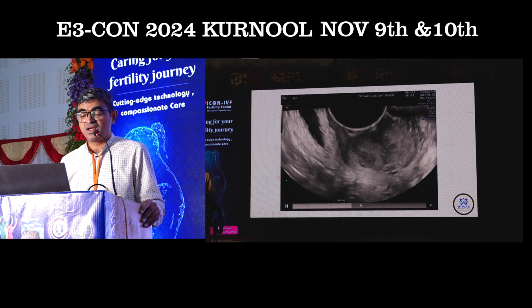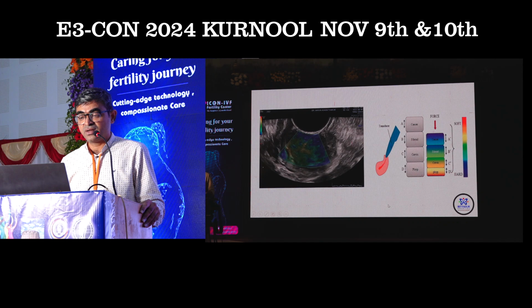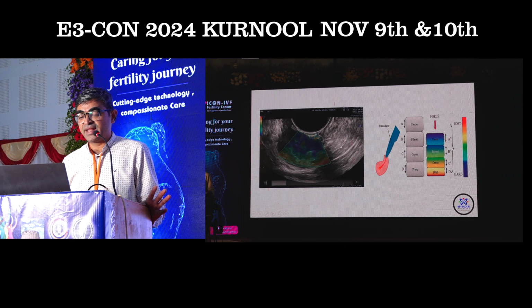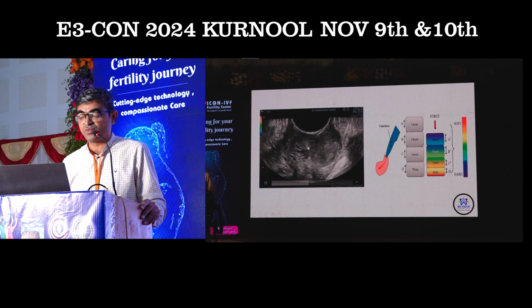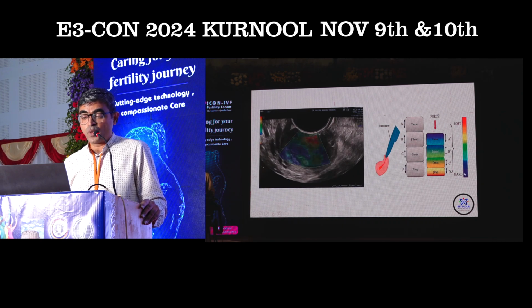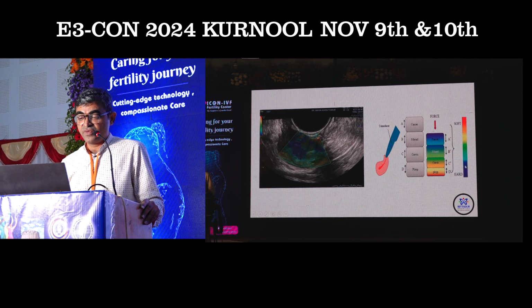You can use the elastography strain here, where I'm very thankful to Dr. Varun Ashok sir, my senior from Pune, who has shared this. Here he is able to show in the shear strain that because it is a harder lesion, you are able to appreciate more blue color on elastography. That means it is harder, and that is likely to be a CA cervix lesion. A polyp will not show such blue hues. It will show more of softness. So that is how we need to differentiate.